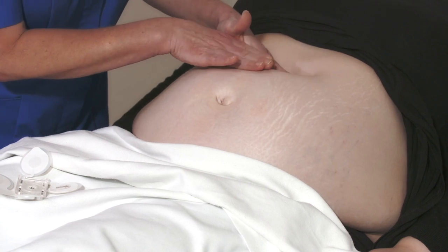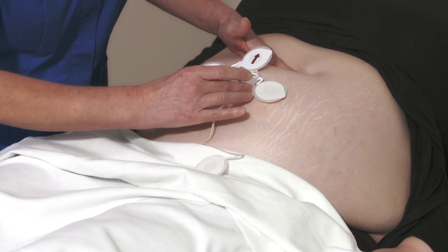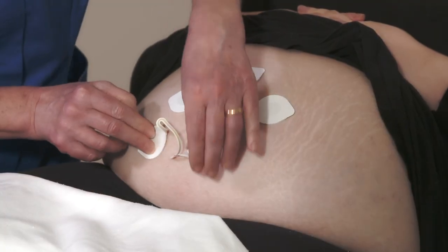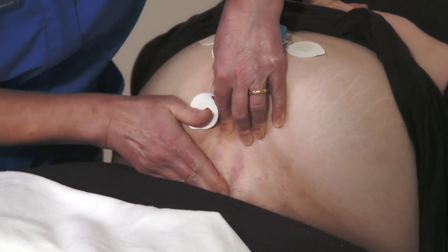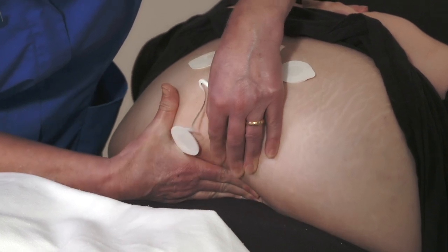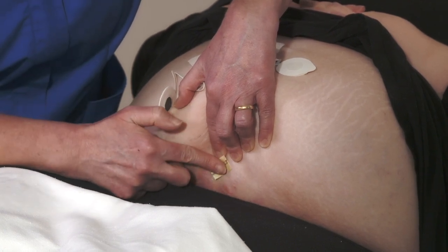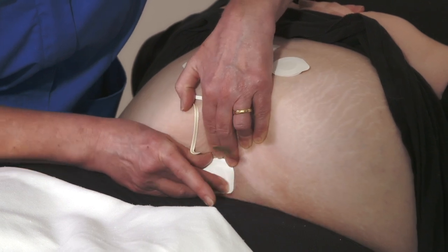Alternatively, position the patch plastic clip along the midline so that the edge of the top electrode marked with the red arrow is placed 10cm or so below the fundus. The lower electrode on the flexible tail should be placed on the top of the pannus 6cm above the estimated symphysis pubis location. An alternative is to reposition the electrode lower down on the abdomen, placing it under the pannus just below the fold.